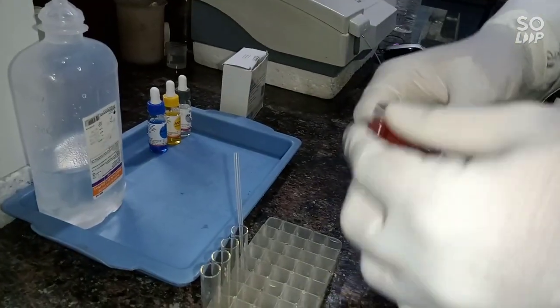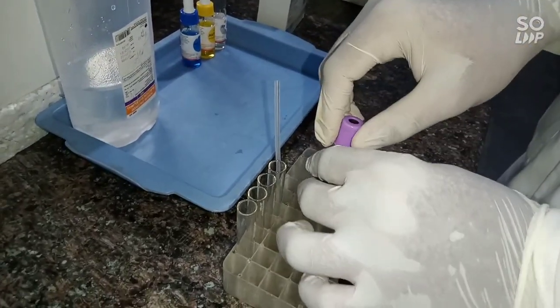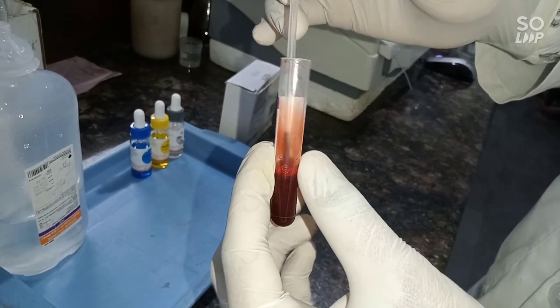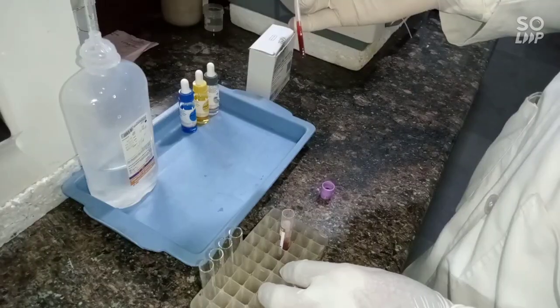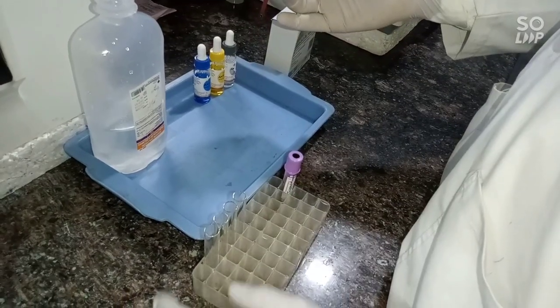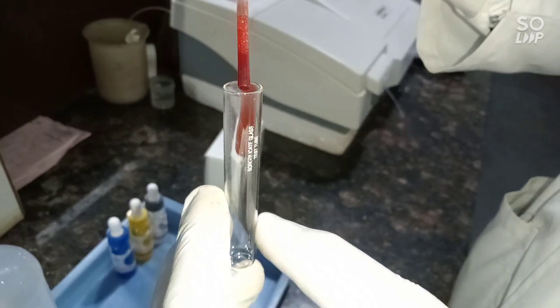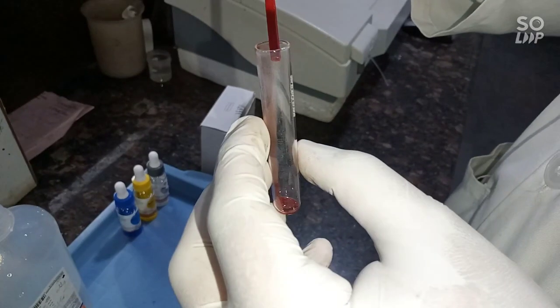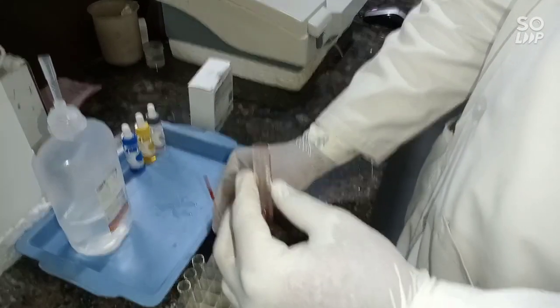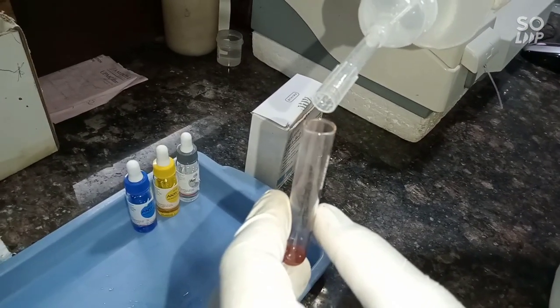First, mix the sample gently with the help of a dropper. Open the cap and take a sterile glass tube. Put three drops of sample in the glass tube — one, two, three. Then add normal saline to three-fourths of the tube and slowly mix.